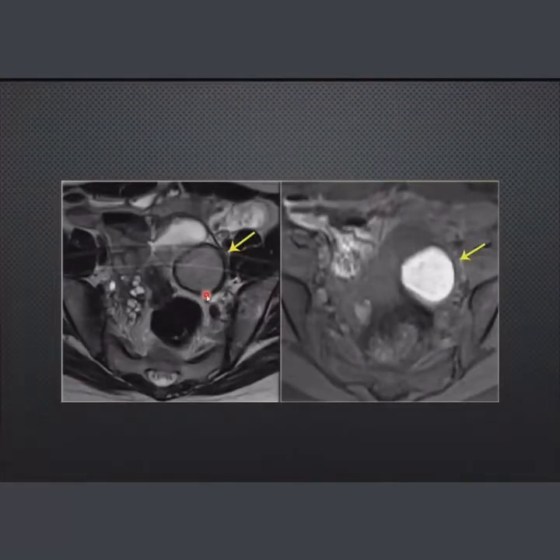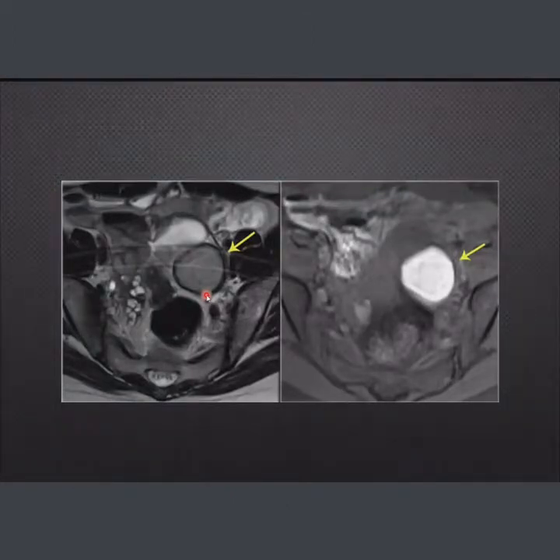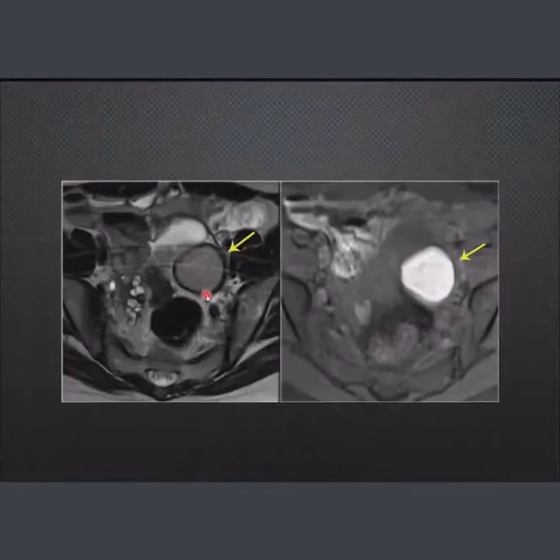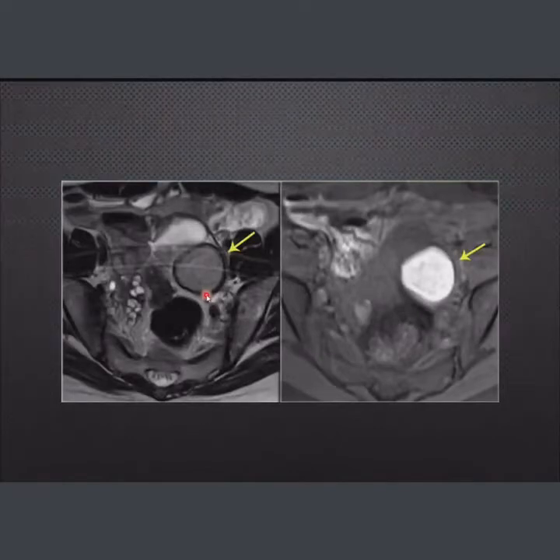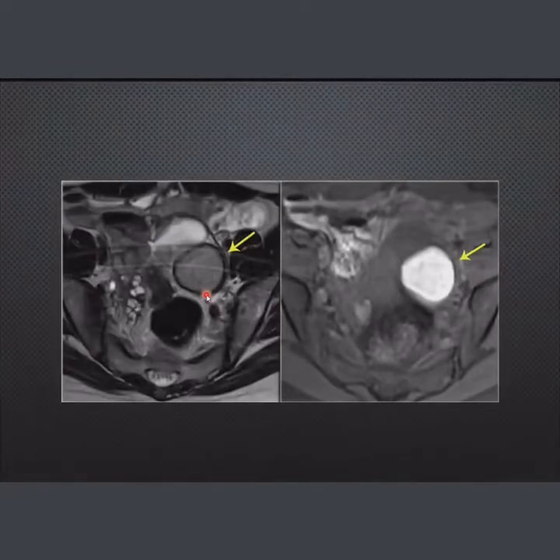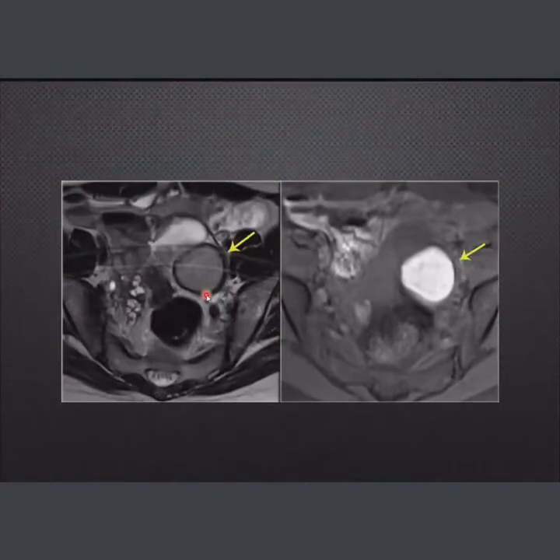Now, returning again, what are we discussing? We are discussing adnexal cystic lesions. We said adnexal cystic lesions may be functional cysts, which are usually simple, and may be dermoid cysts. This is easy to recognize because on CT it will have fat and calcification; on ultrasound I may be misled, but on MRI it is very characteristic, bright on T1 and disappearing on fat suppression. The third condition is tubo-ovarian abscess as part of pelvic inflammatory disease, and we said it is like any cyst with an enhancing rim, and the patient will be systemically unwell, having features of infection.